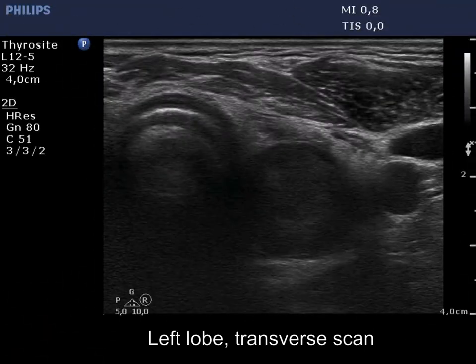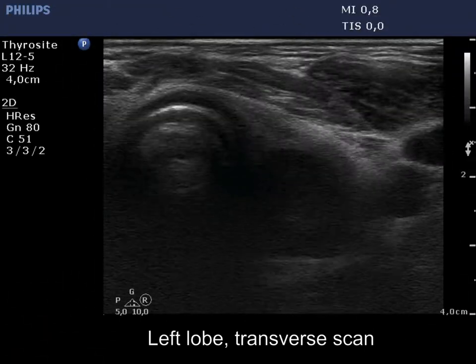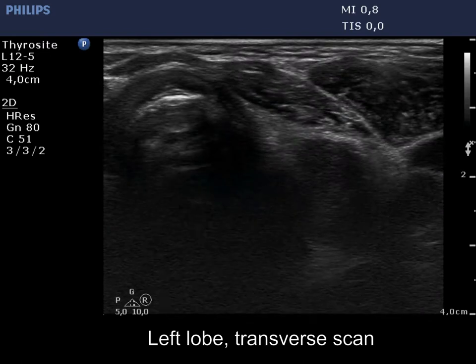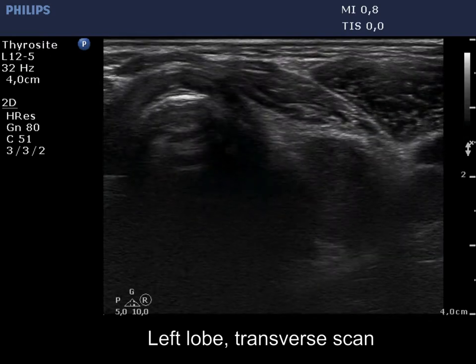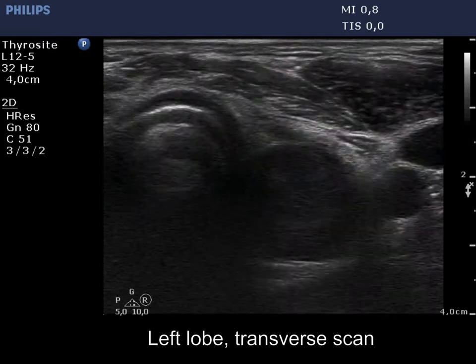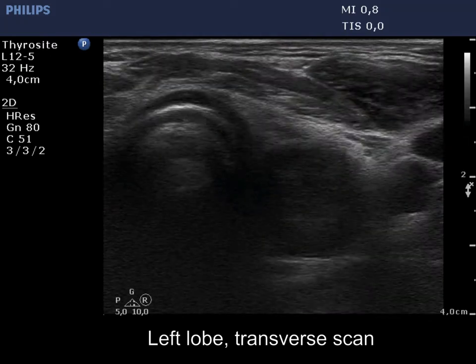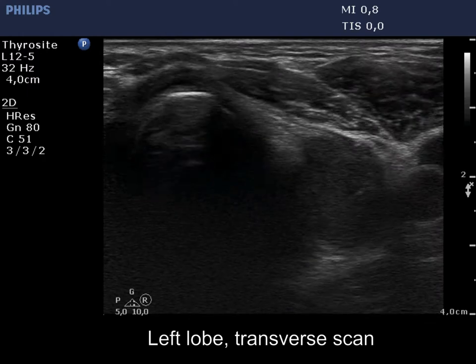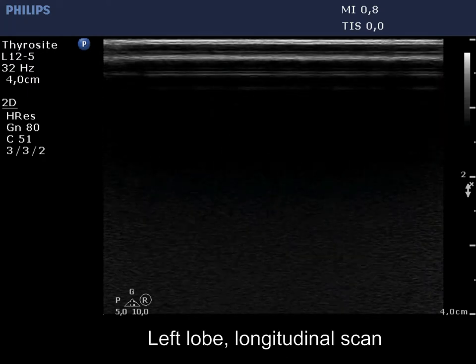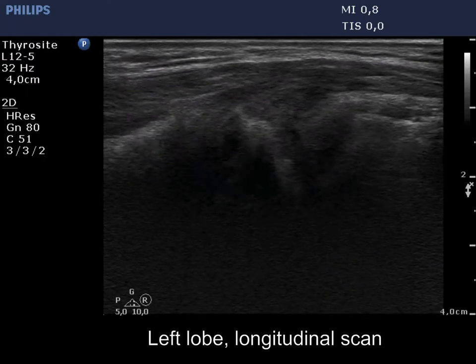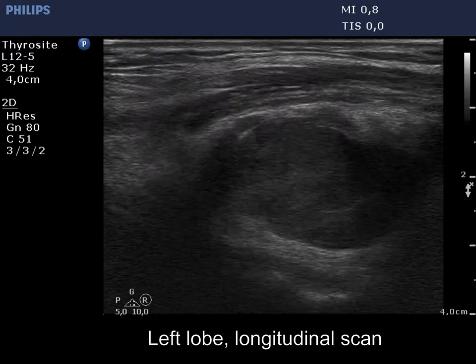The transverse view of the left lobe is deceptive — it seems like the lobe had a large hypoechoic nodule. On longitudinal scan, we can see that there are numerous hypoechoic areas with irregular borders.